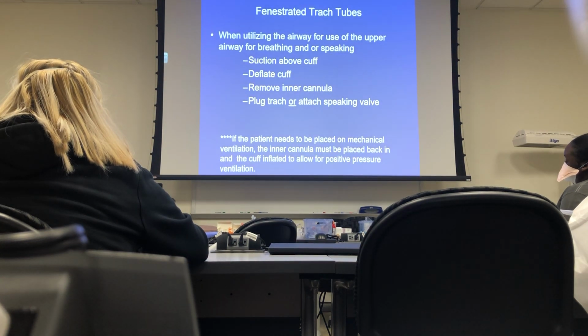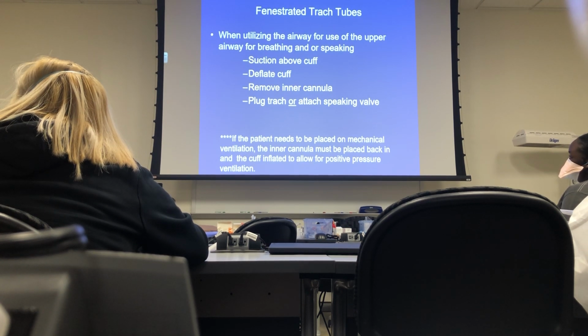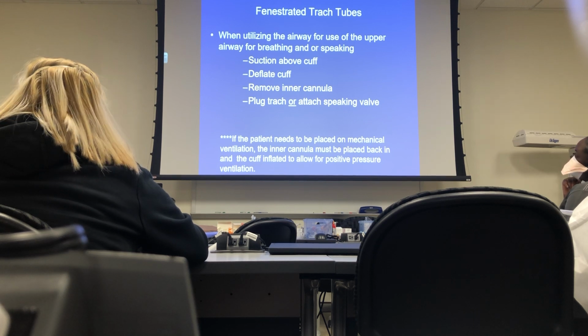All right, if the patient needs to go back on mechanical ventilation, what do you have to do? So, you plug them during the day, you get a call at 3 o'clock, the patient's not doing well. You go upstairs, you decide they need to go back on the vent. What do you do? Inflate the cuff. Take the plug out. Put the inner cannula in, reverse the steps. Okay. Take the plug out, put the inner cannula in, inflate the cuff, and put them back on the vent.